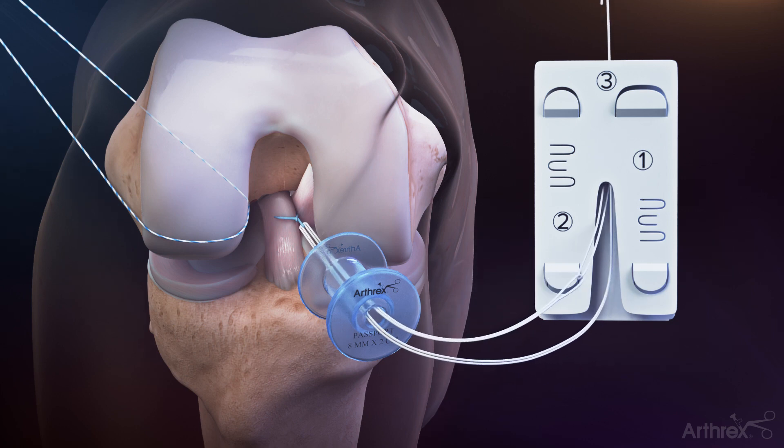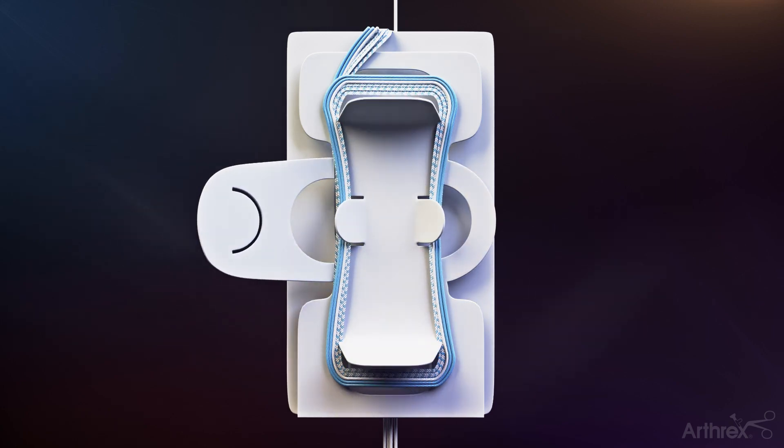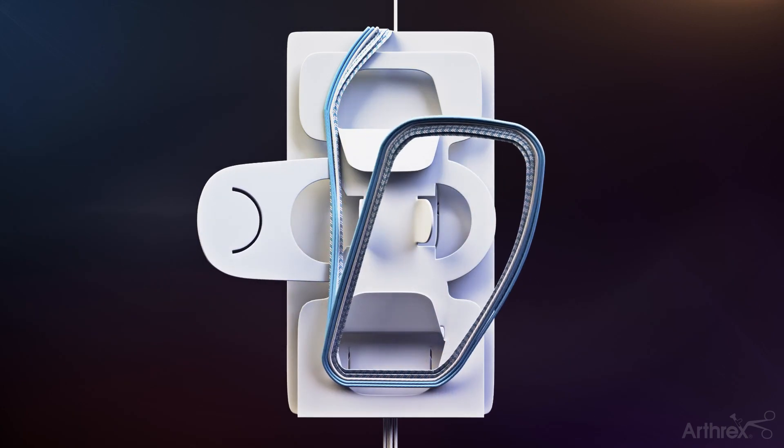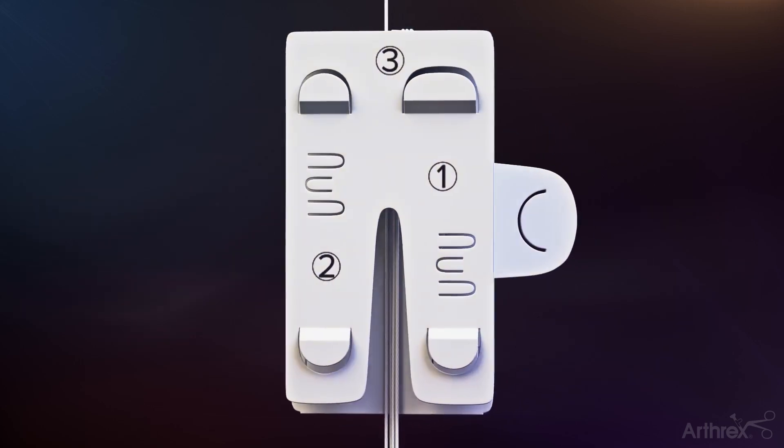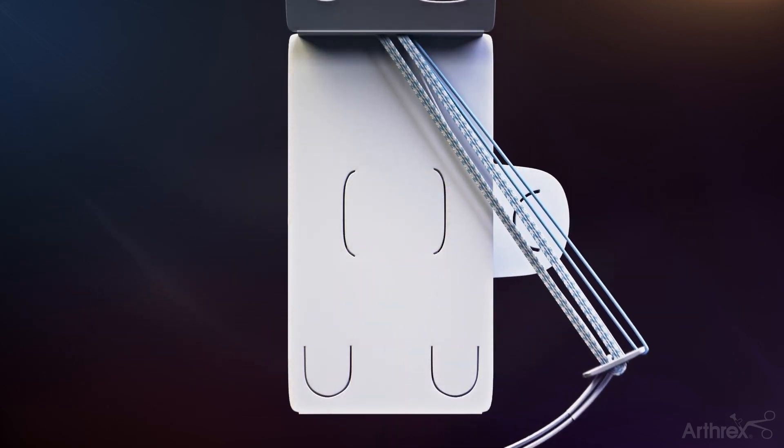Place two fingers over the top of the card and pull the blue threader to complete the pass. Pull the newly created white shortening strand to remove slack from the loops. Unsnap the packaging on the back of the card and pinch down the suture cleat to retrieve the sutures. The assembly card is opened, the construct removed, and the card discarded.